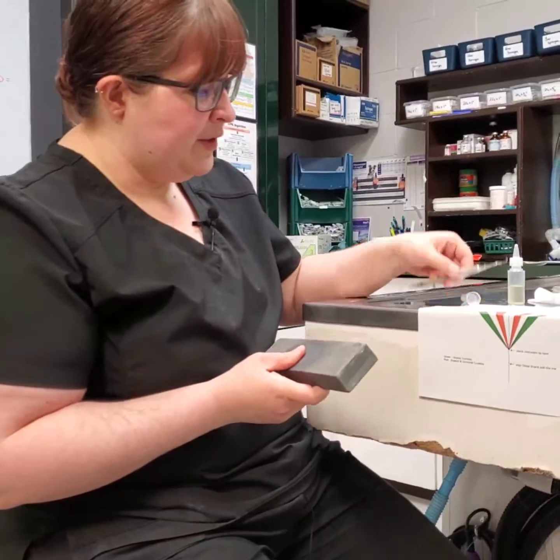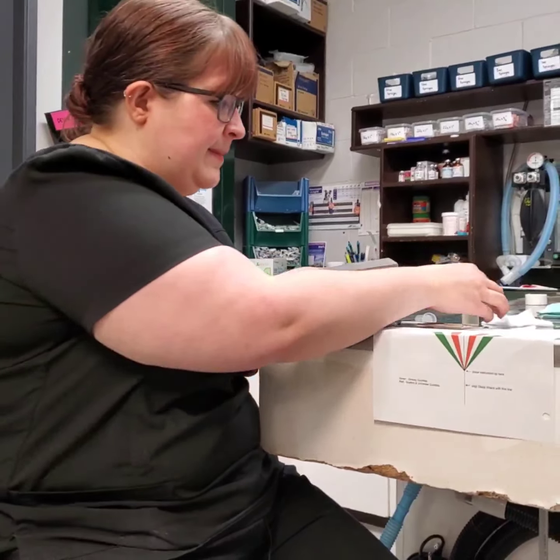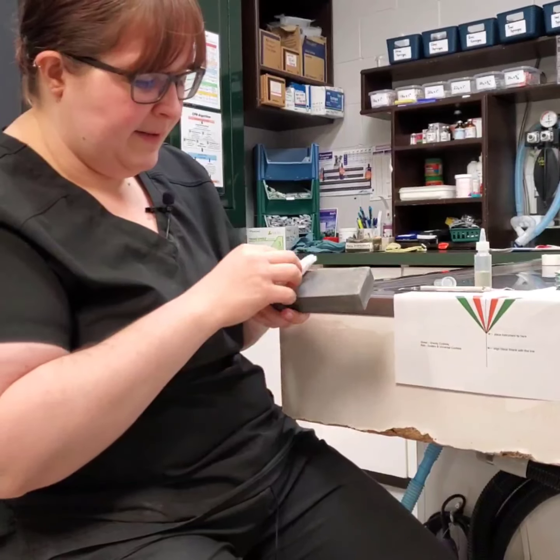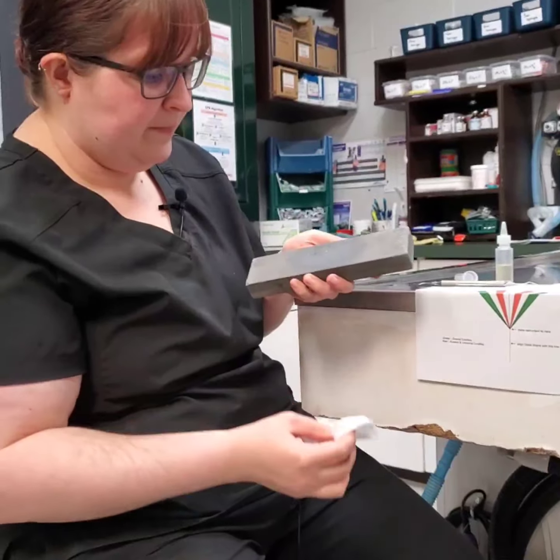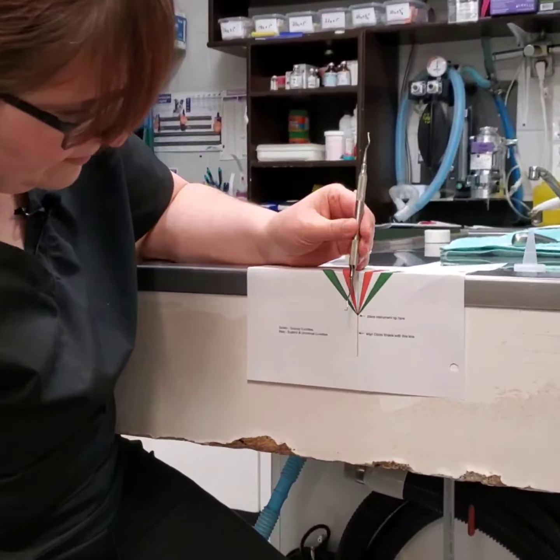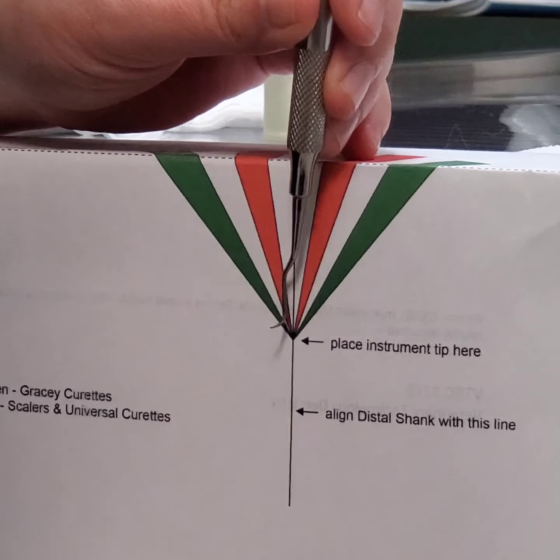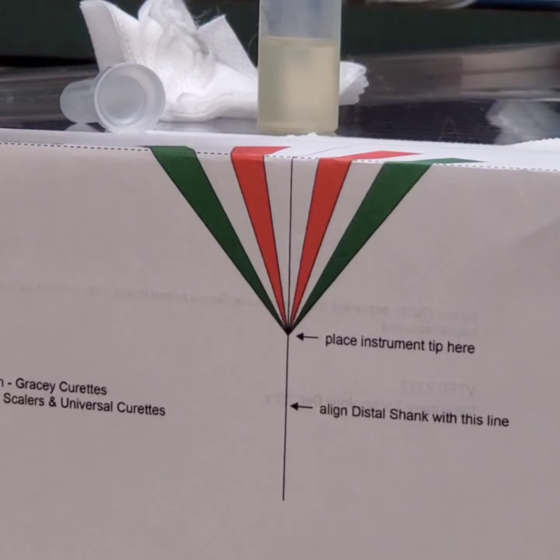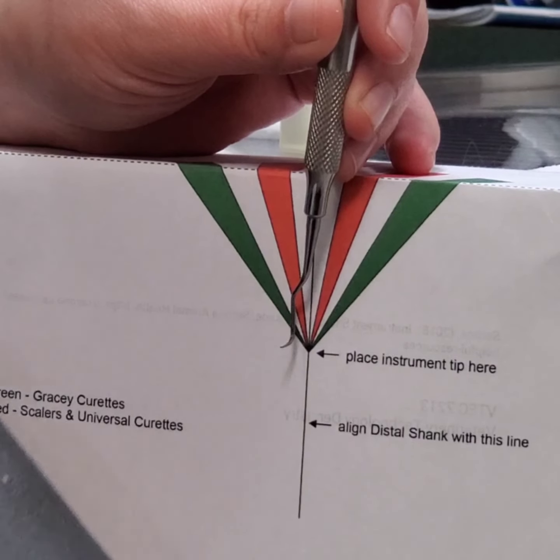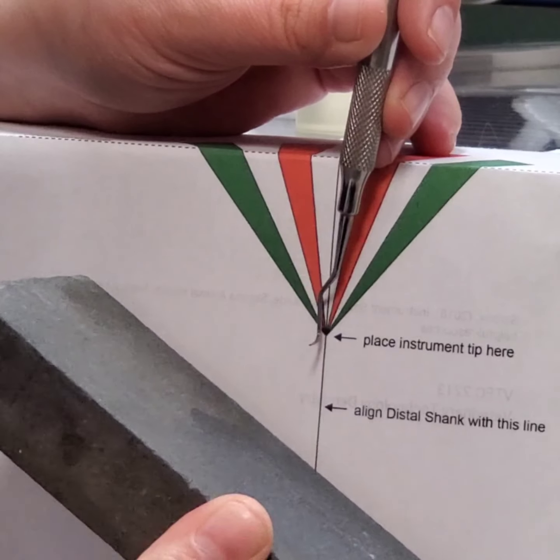So now I'm going to be sharpening the Gracey curette, and I'm going to be starting off by adding some of the sharpening oil to the stone, and just using the piece of gauze here to spread that oil around. And now I am going to take the curette here and use my sharpening guide, and I'm going to line up the distal shank with the central black line. And for the Gracey curettes, I'm going to be going at the angle of the green line. So I want the tip there, and I want it perpendicular to the floor.